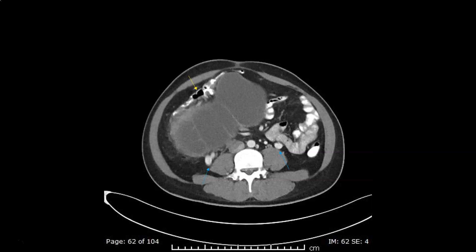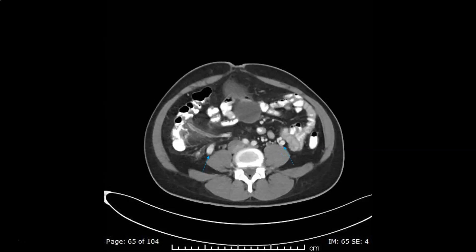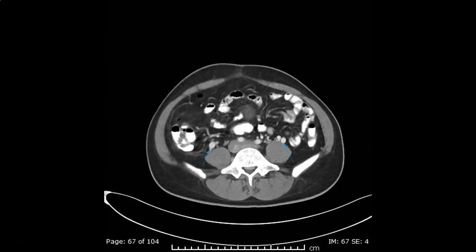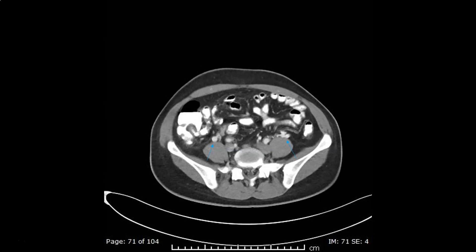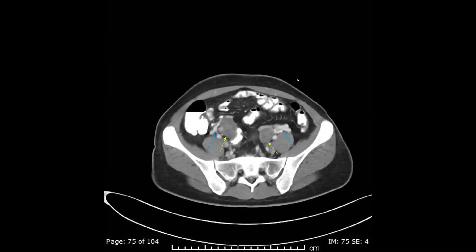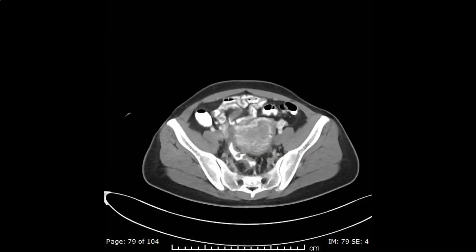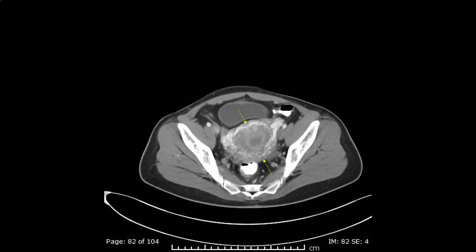We see downward displacement of the transverse colon, and we can still trace the ovarian veins down until they join the ovaries. The ovaries are pointed to by the yellow arrows.